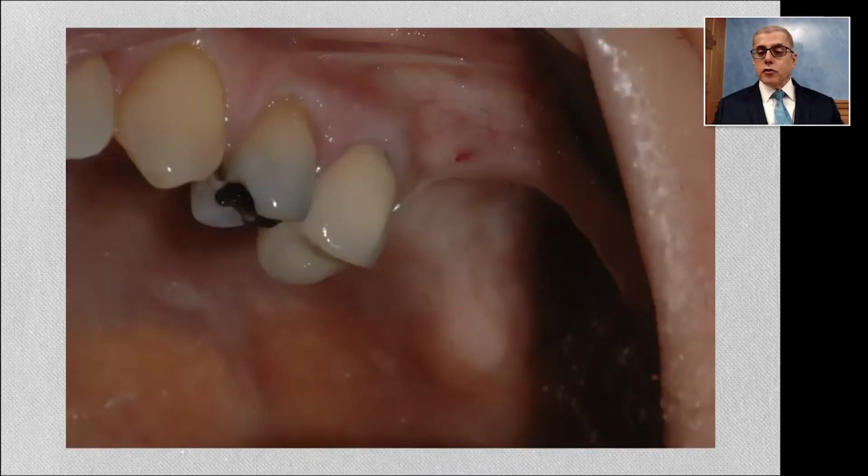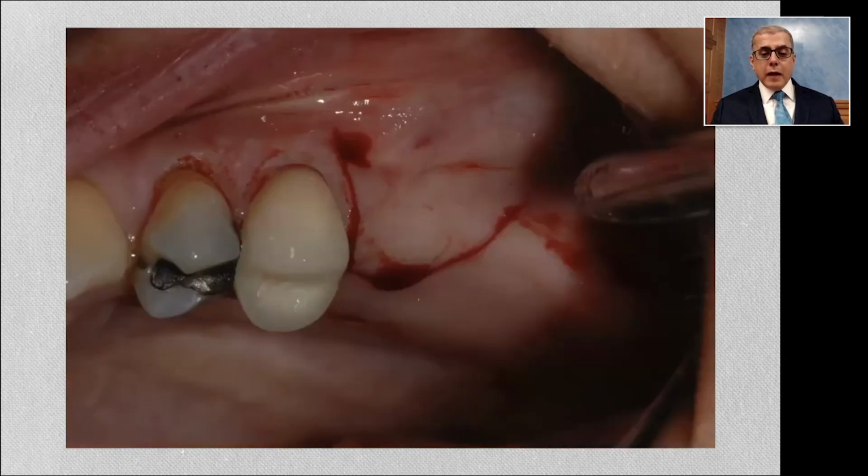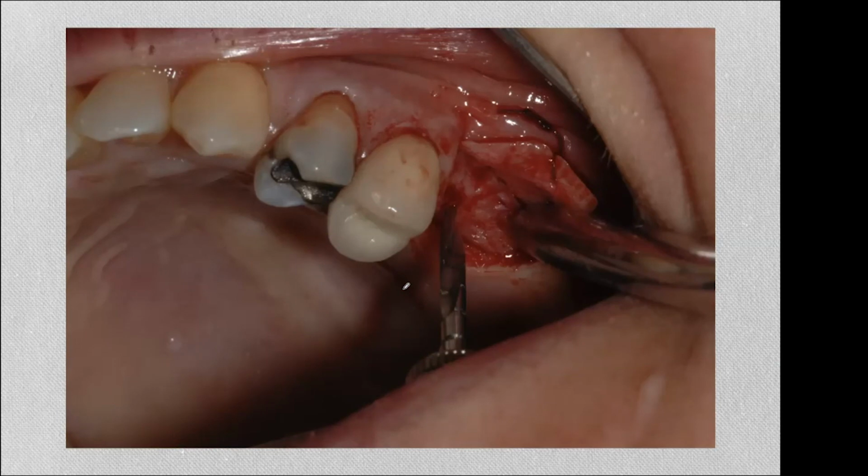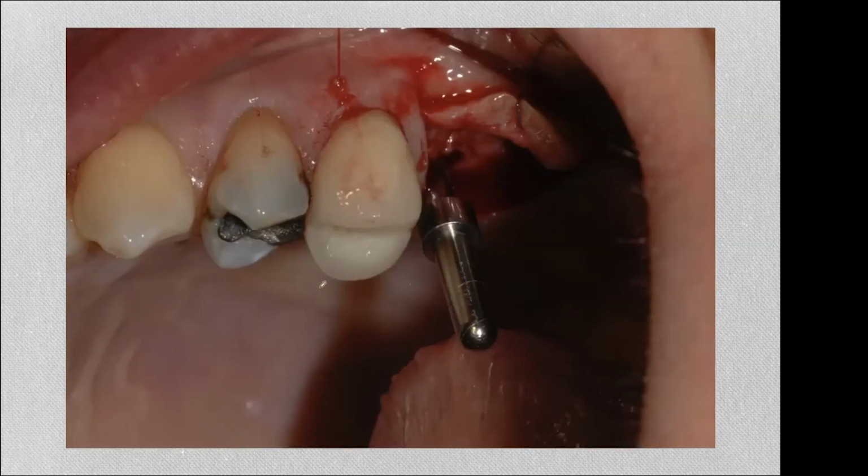So on the day of surgery, we open a conservative flap, again, papilla sparing, but I make it fairly wide just in case I have to do more than the internal lift. So always think in terms of contingencies. Okay, we open the flap, put a retraction suture, mark our location, and go to a depth of about 2 millimeters or so. Just check the angle and location of the implant.